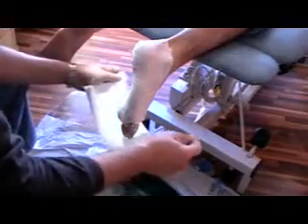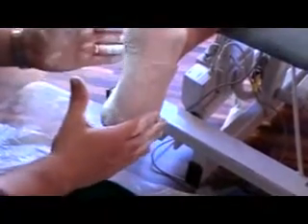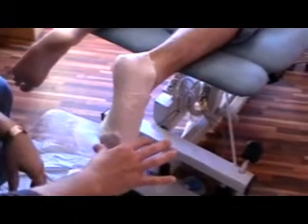You wet the bandage, keeping it flat, and apply one side only. Be sure to cover over the sole of the foot, and when you apply the second aspect of this bandage, keep the front of the toes relaxed. Always avoid putting tension around the front of the toes. You can use a small amount of tissue to place on the fourth and fifth metatarsal head — this stops your thumb from slipping.